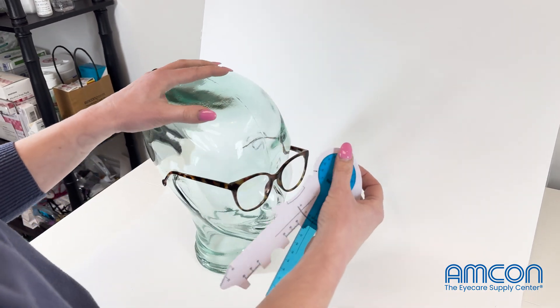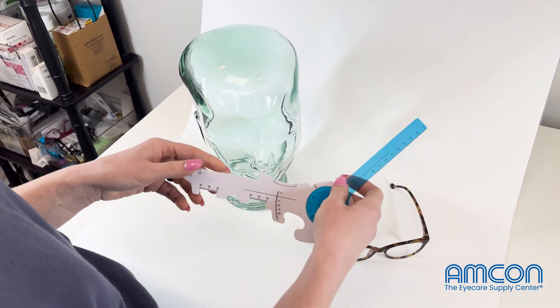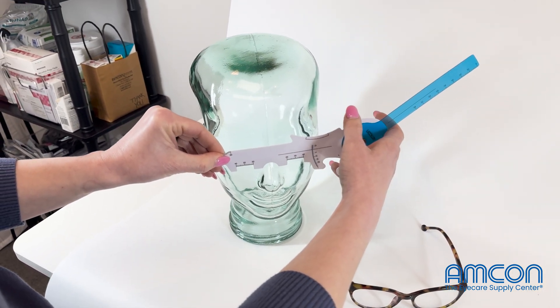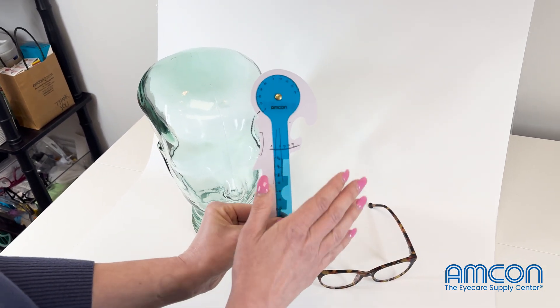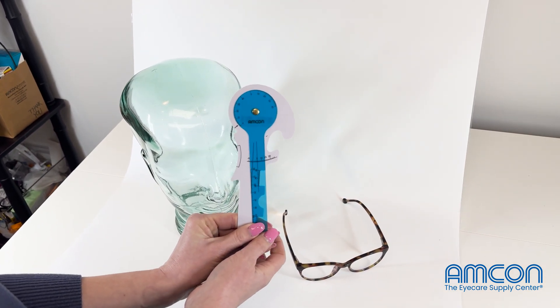Last but not least, just in case your digital pupilometer doesn't work or you don't have one, you also have your PD measurement here to measure that patient's PD. So this really is your one-stop shop in terms of any and all lens measurements.